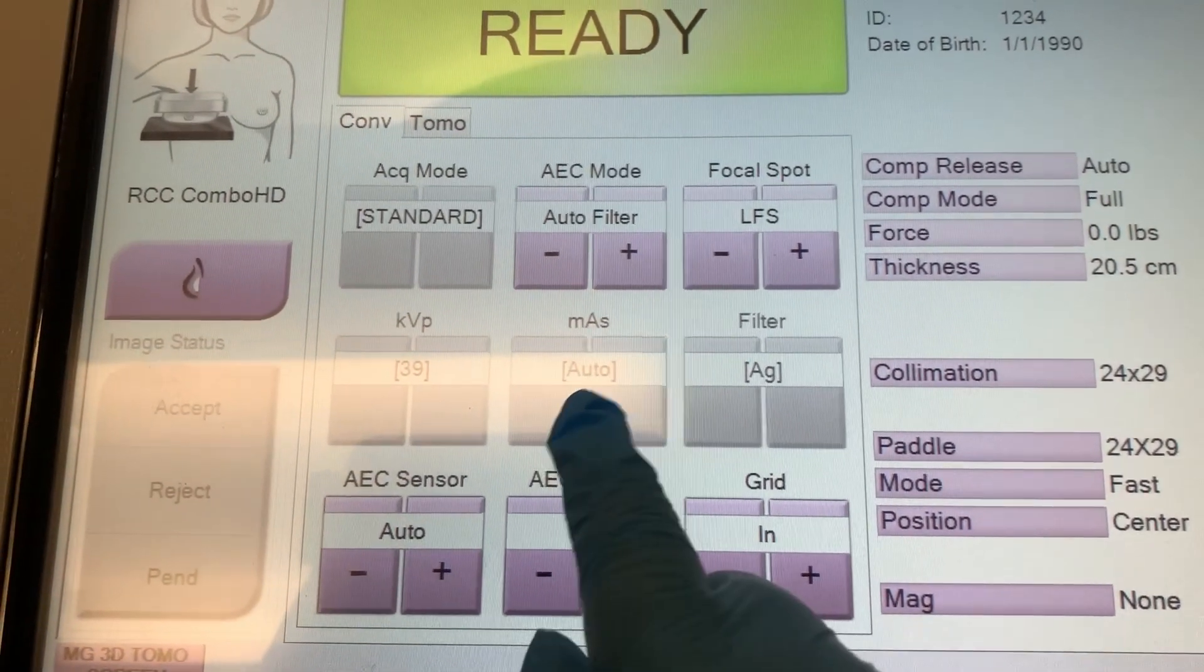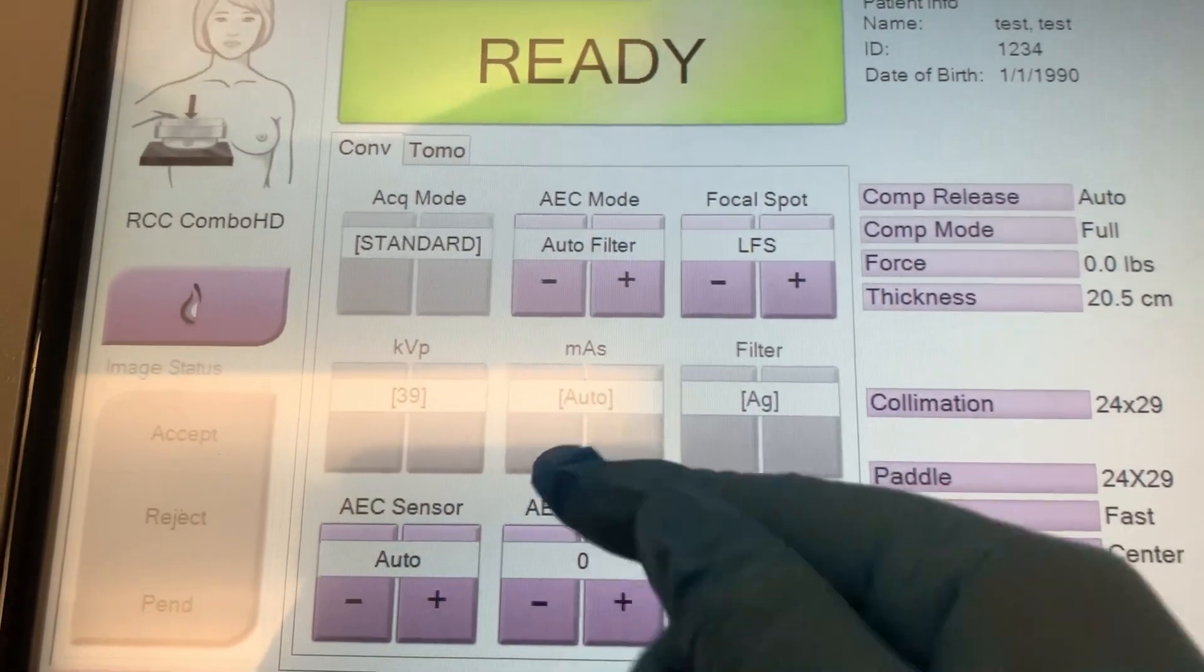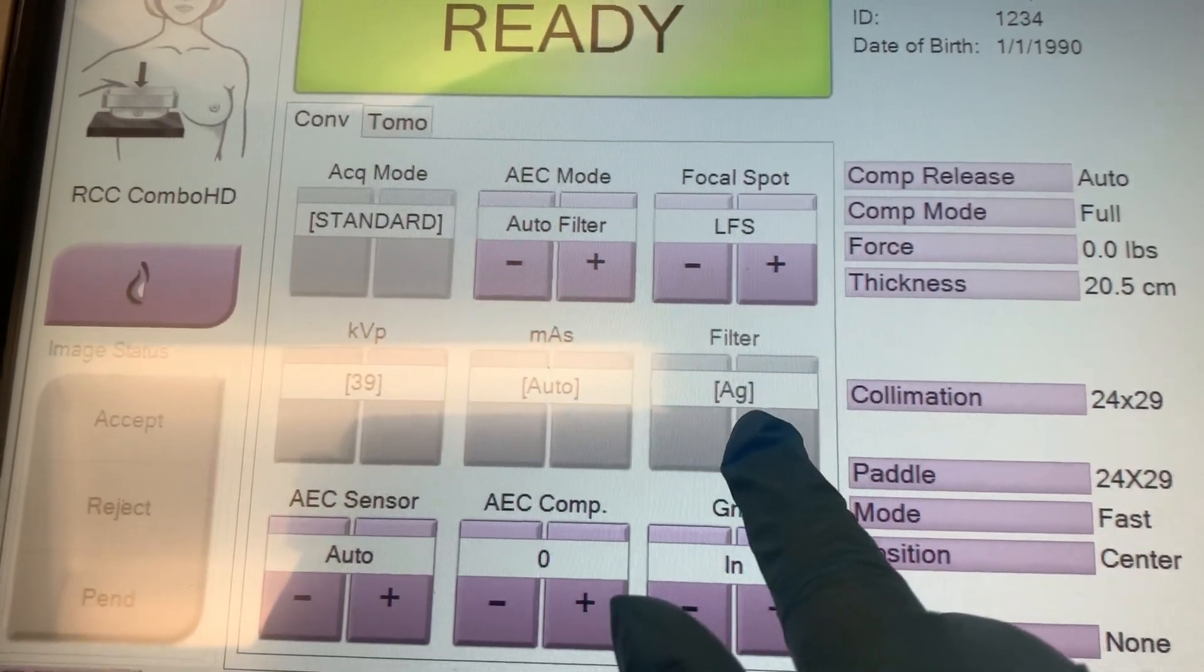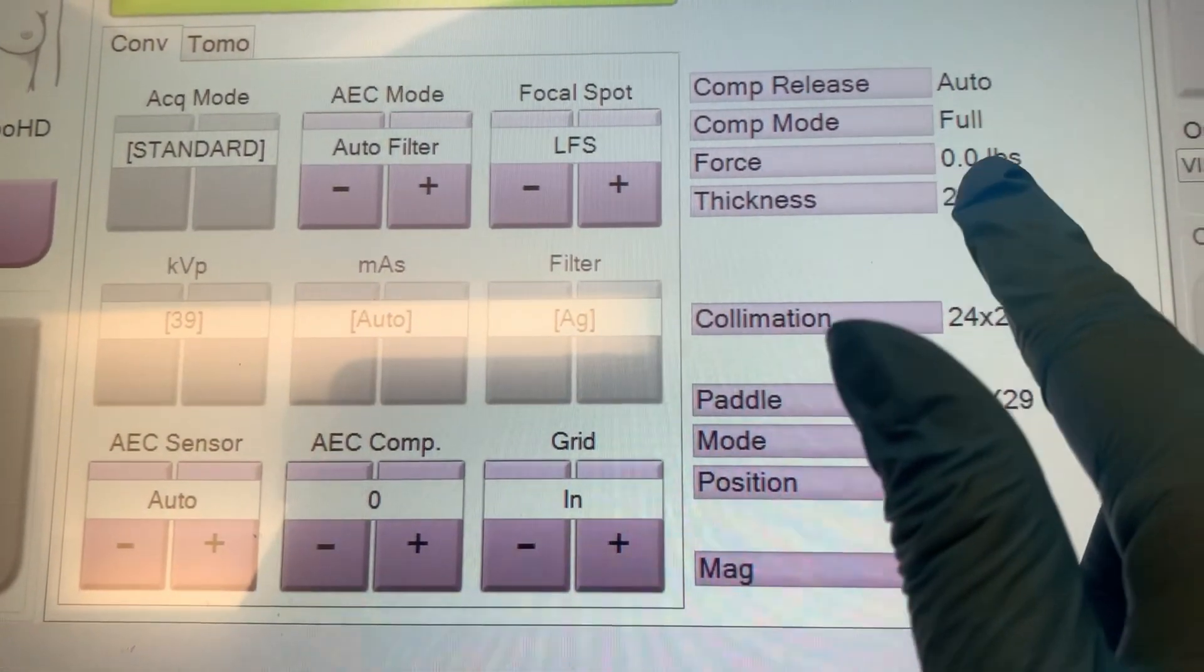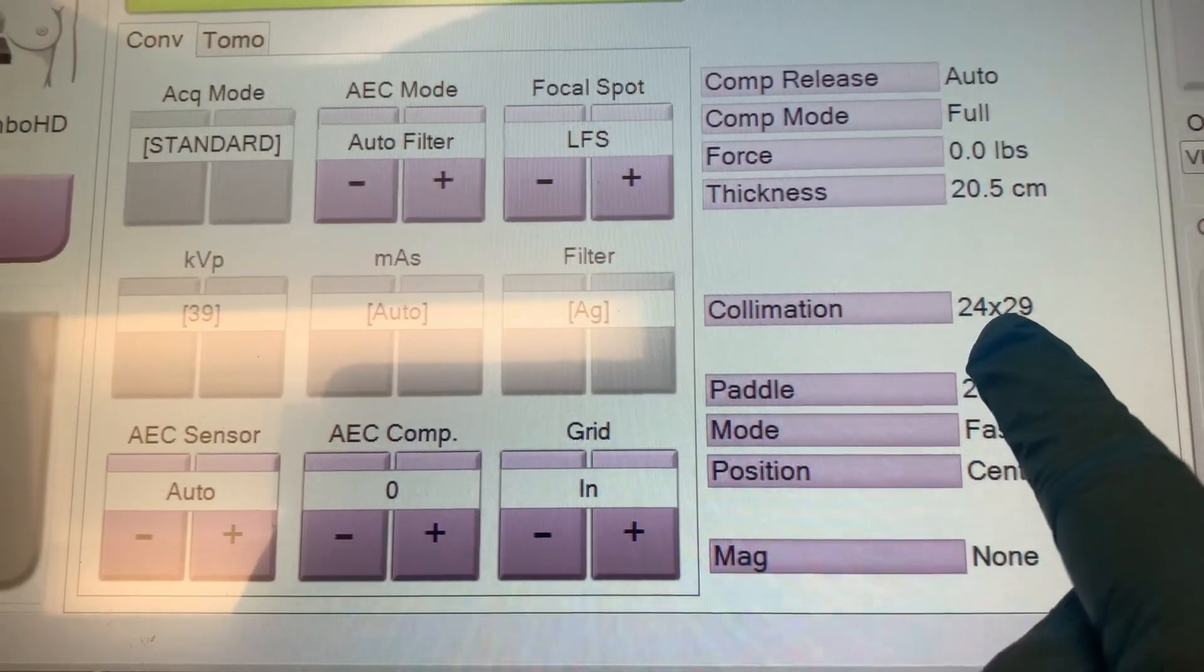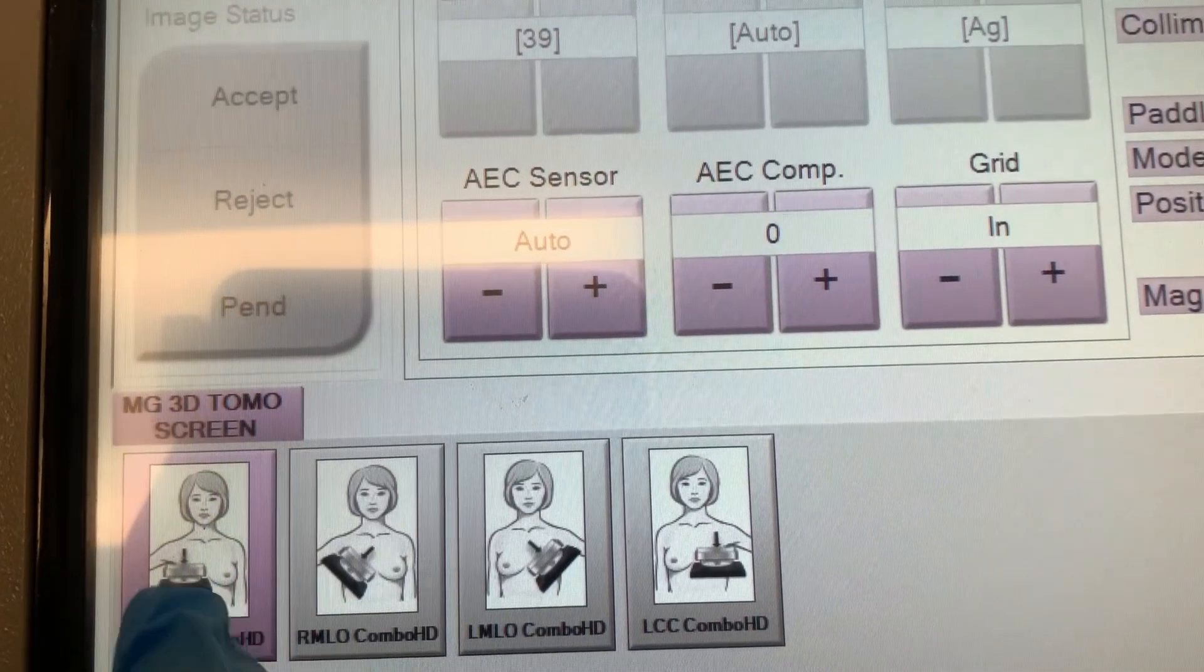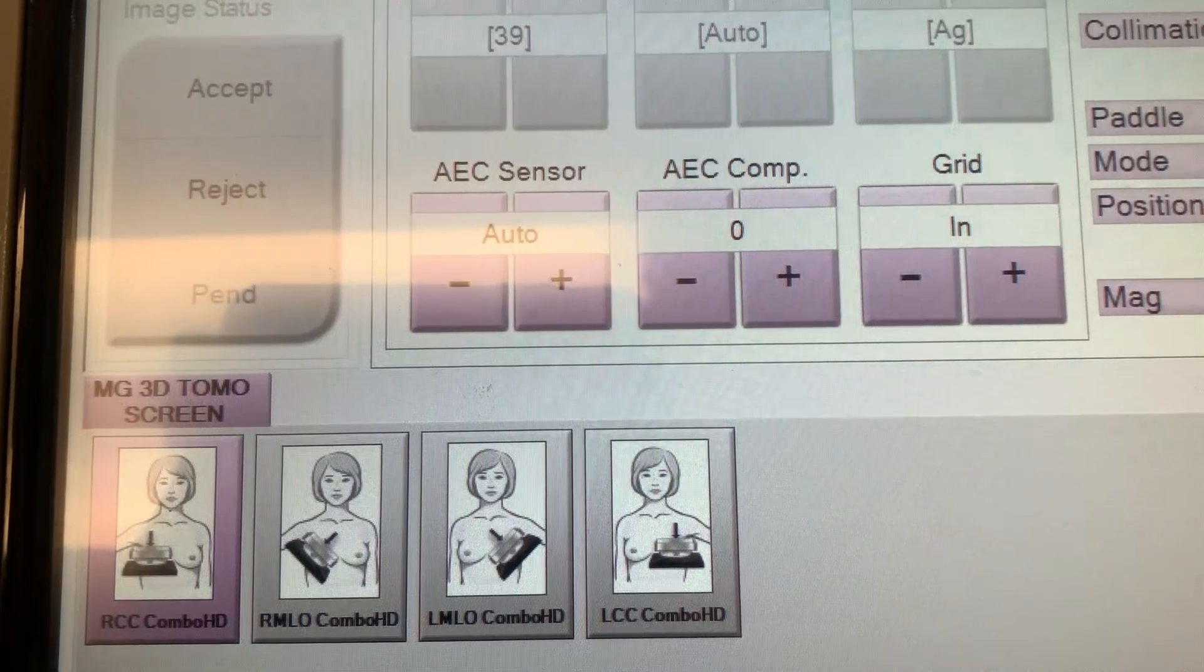But the mAs is set to just AEC. So it will automatically adjust the mAs with this setting. And then for your filter, you can see it right here. And then this is how many pounds you're giving the patient, how thick the breast is, what paddle size you have. And the paddle size right here is showing what paddle size the collimation is set at. Then right here, you see your different pictures that you have to do.